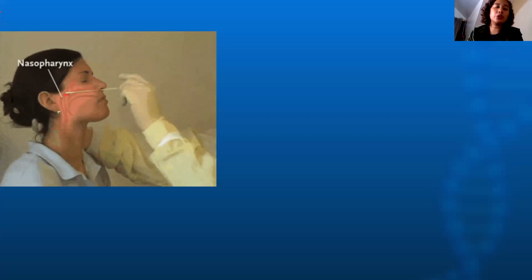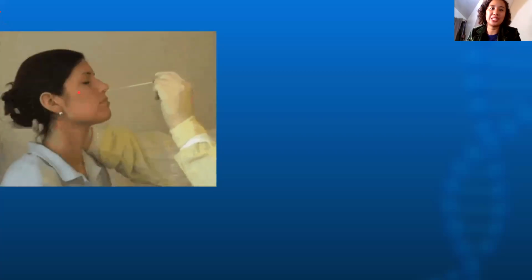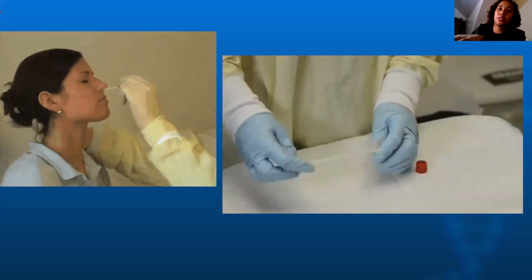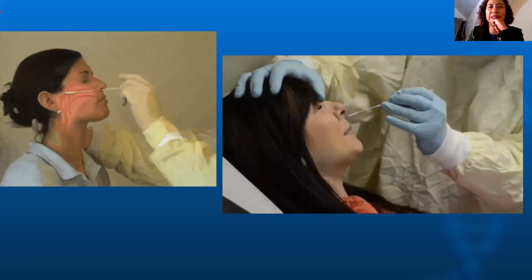Okay? So until you will meet a resistance. So parang ang layo ata nang napuntahan mo siya doon. Usually ganyan lang. Sa gitna, mga 2 inches. Sa half daw eh. Halfway. So, ilalagay sa VTM.